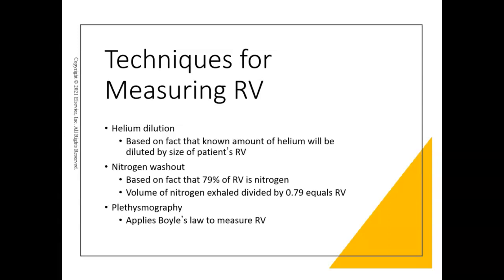And I would want to verify that then with spirometry. If my spirometry doesn't show an obstructive lung disorder, but my RV is elevated, then I have some error in my testing somewhere, because those two things cannot be separated.